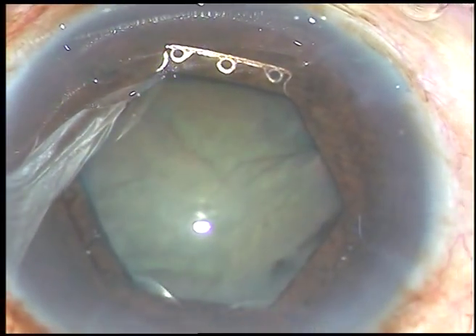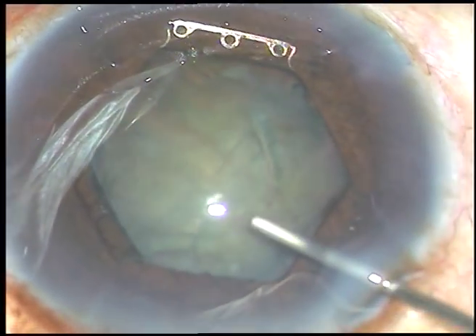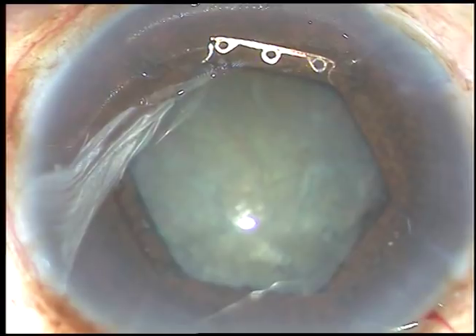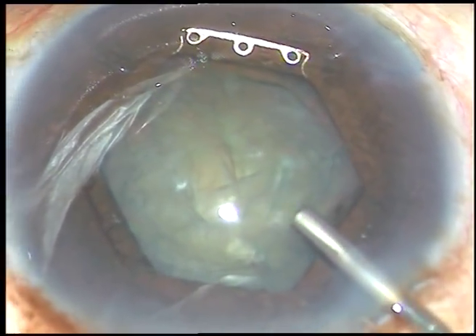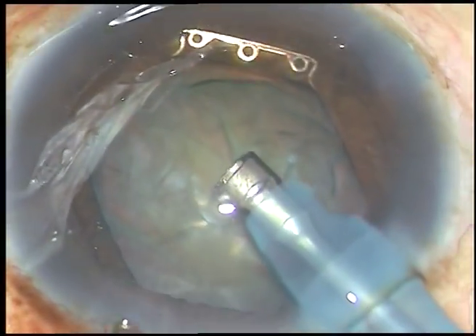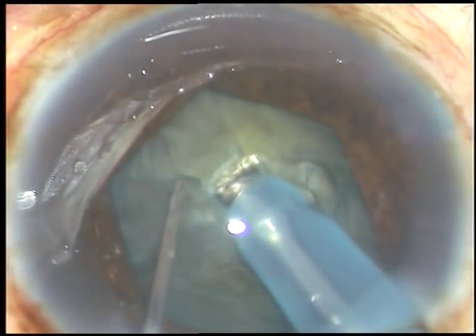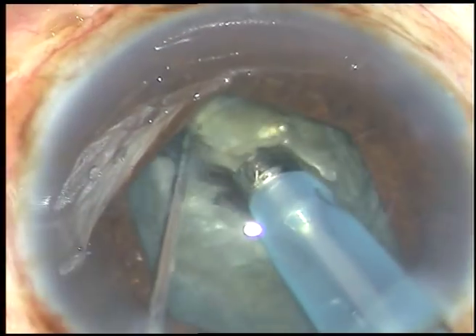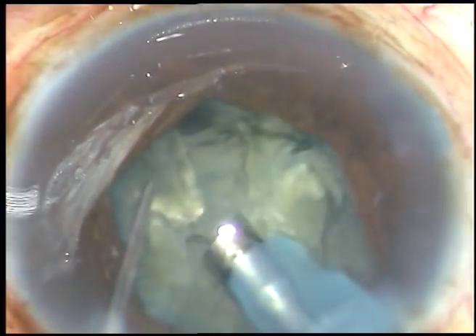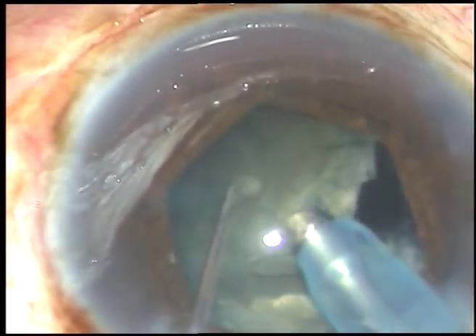Now this is hydrodissection. This device does not cause any hindrance in any step of surgery. The pupil is hexagonal and it gives more room to work than a rectangular or square shaped device would provide. I have started managing the nucleus and this is direct chop. I hold the nucleus firmly with high vacuum and chop it. I am using 450 mmHg vacuum. The machine being used is Alcon Centurion. Flow rate is 45 ml per minute and FICO power being used is 70%.